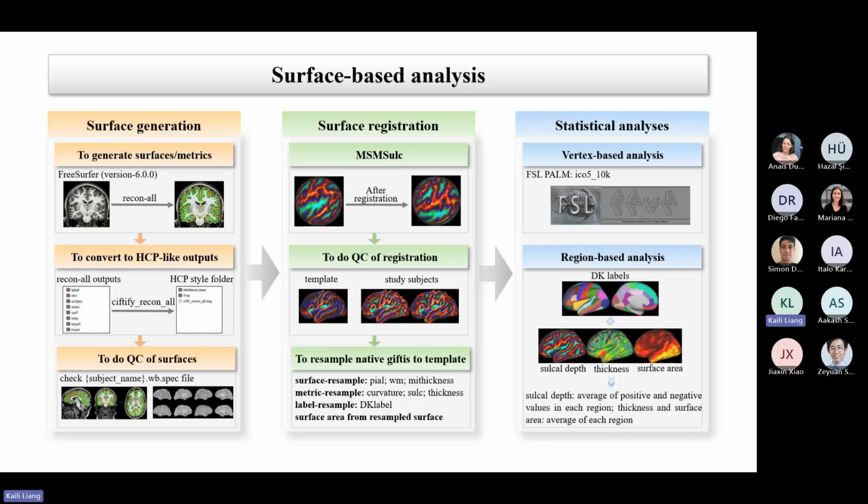It's like, oh my god, it means there's a problem with replication. How can you even start enforcing a level of longitudinal consistency if you ran the same subject twice and they come out completely different? Even for the same participant scanned at different times or on different machines, the surfaces are different. But this is the same scanner and everything: the same image, run through the FreeSurfer pipeline twice on different systems.